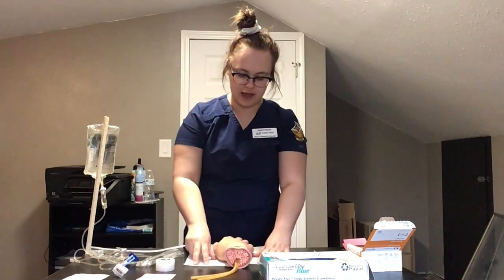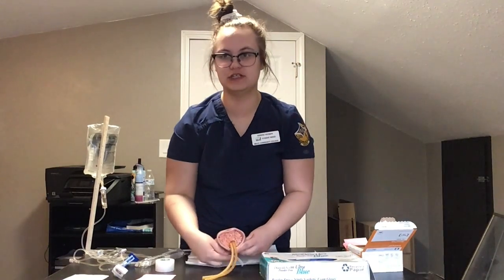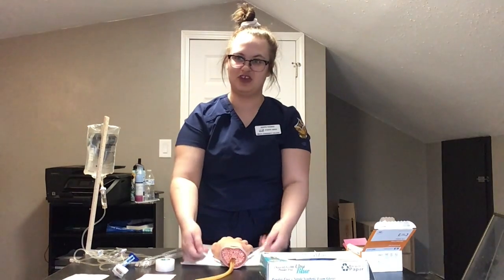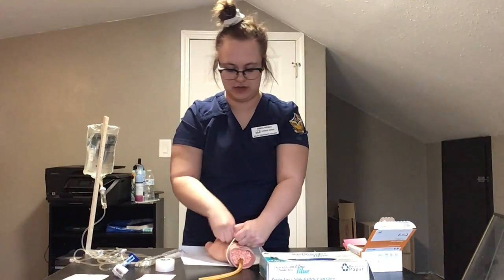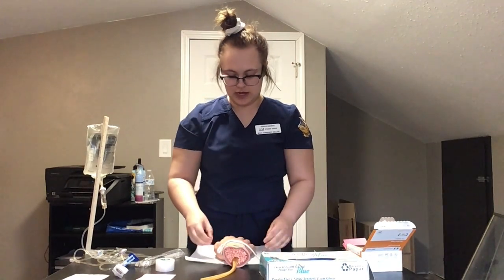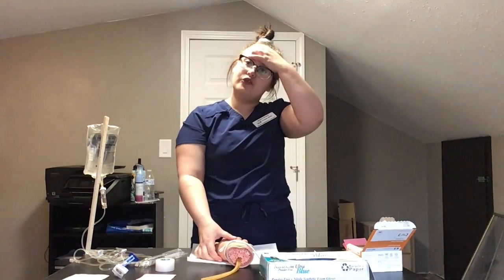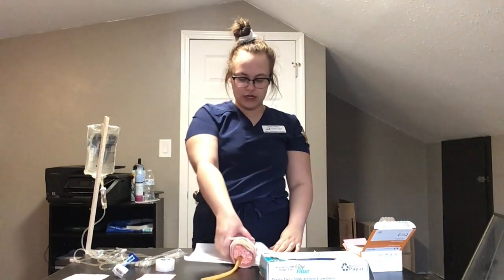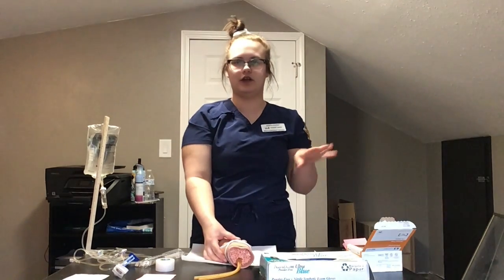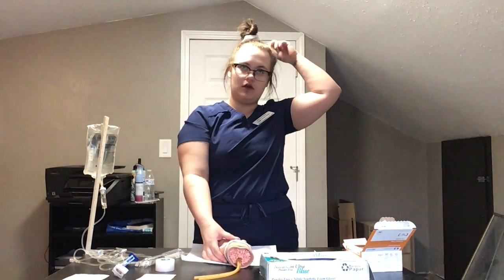I would apply the tourniquet 4 to 6 inches above the site, which isn't really possible since I just have a hand, so I'm going to do my best. Then I would palpate for a radial pulse, and if I don't feel one, then I would loosen the tourniquet. If I still don't feel it, then I would take the tourniquet off and start again.